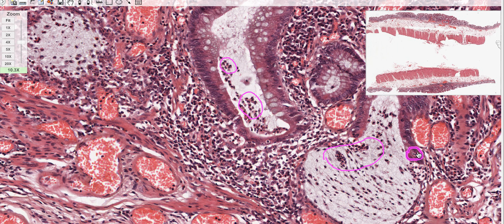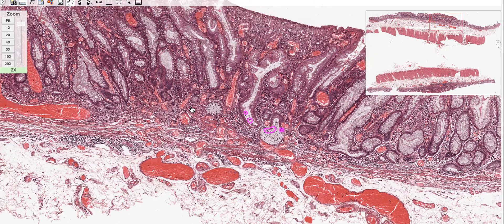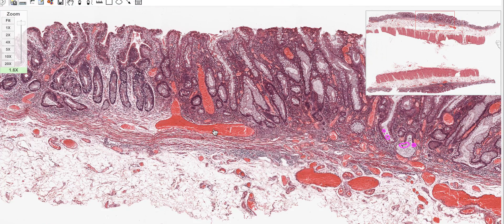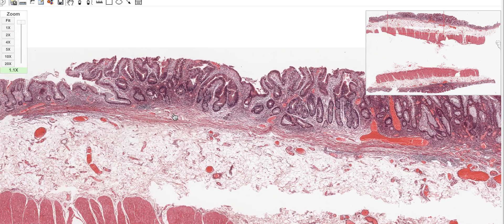I'm seeing crypt abscess and cryptitis in a slide with no granulomas and no transmural inflammation. Cryptitis and crypt abscess are nonspecific - not specific for either ulcerative colitis or Crohn's disease. So what makes me diagnose this as ulcerative colitis specifically? This tiny streak of pink layer is called the muscularis mucosae. Normally, crypts come down almost touching the muscularis mucosae, but in ulcerative colitis they recede back. The area between the edge of the crypt and the muscularis mucosae is called the basal area.